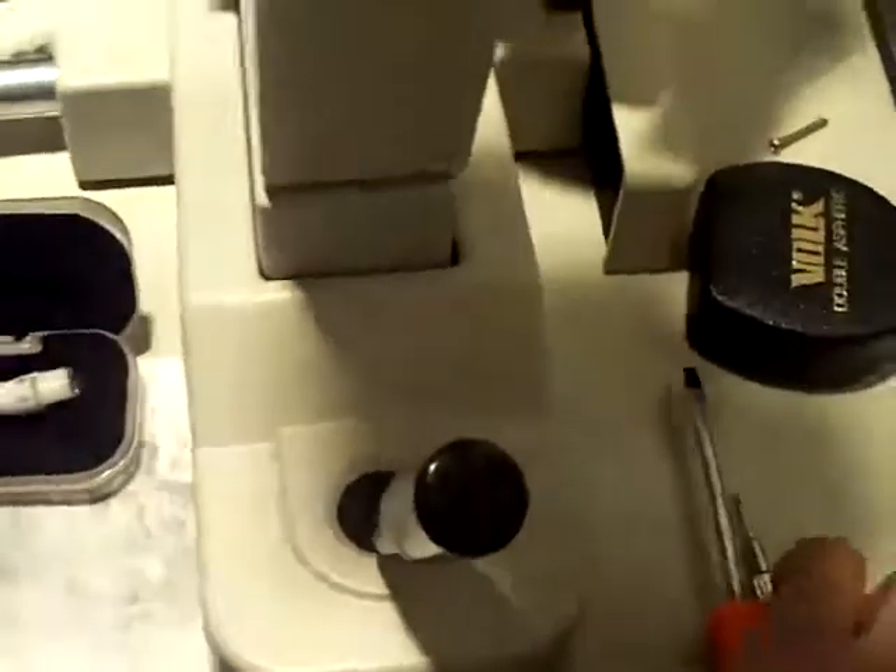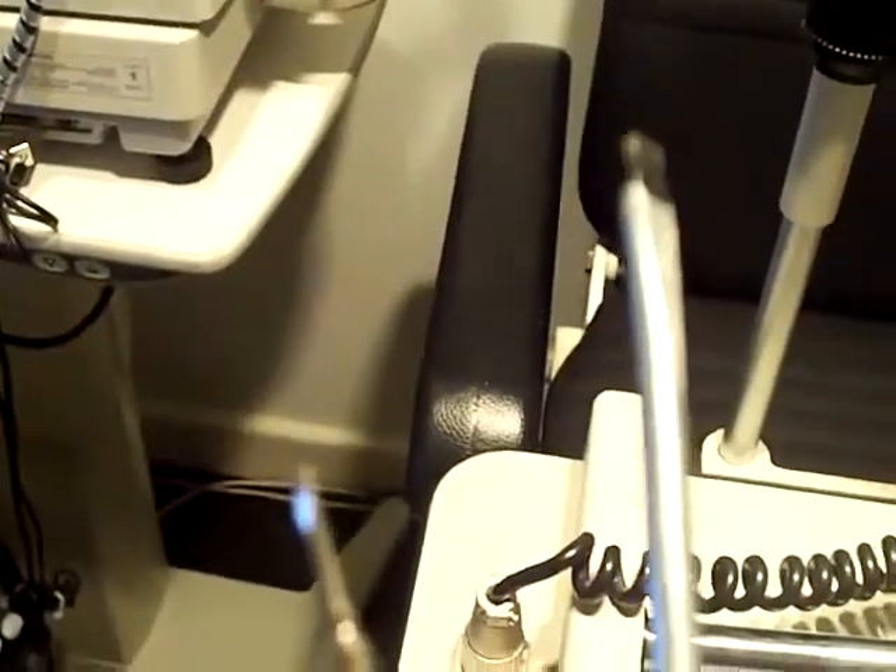For this task you will need two screwdrivers, preferably one small and one large.